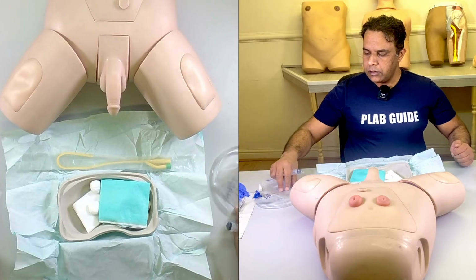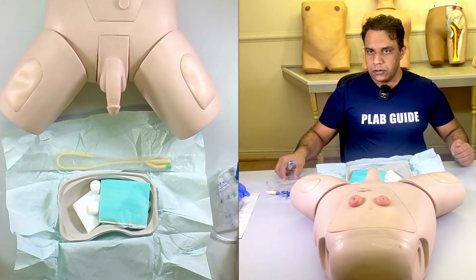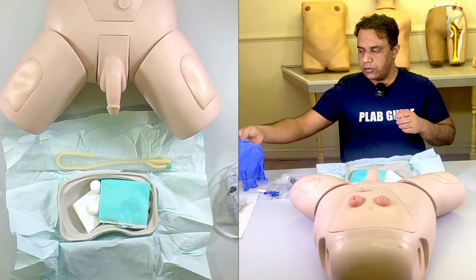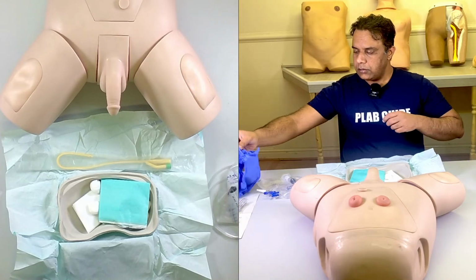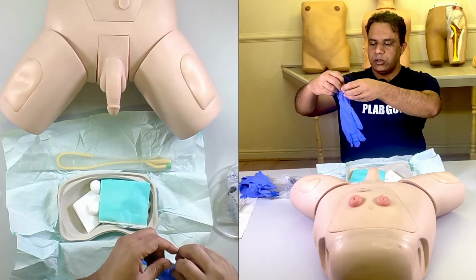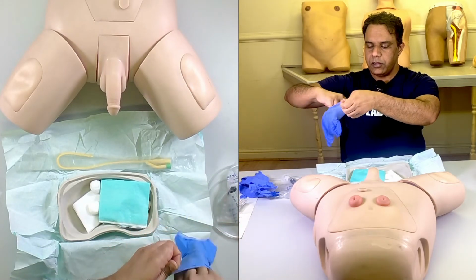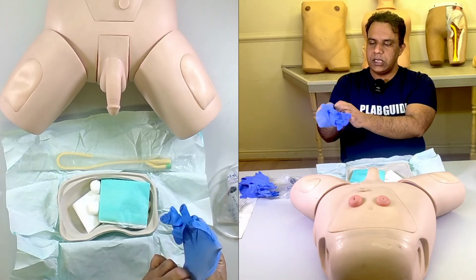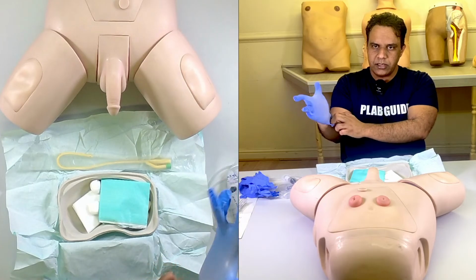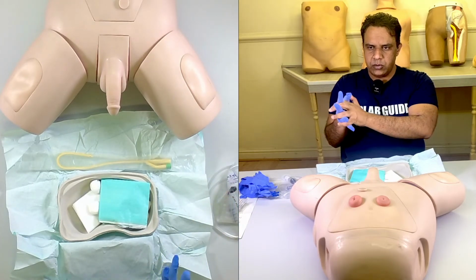And you have the urine bag ready, and now I'm ready to catheterize the patient. And before I do that, I'm going to use 1 pair for the sake of this video. However, you need to make sure that you mention that you will need 2 pairs of gloves.